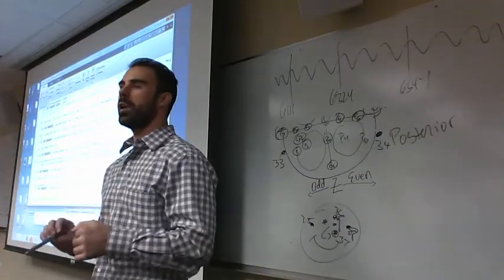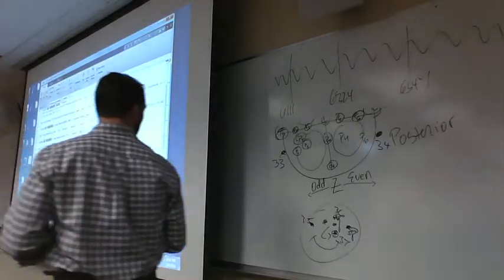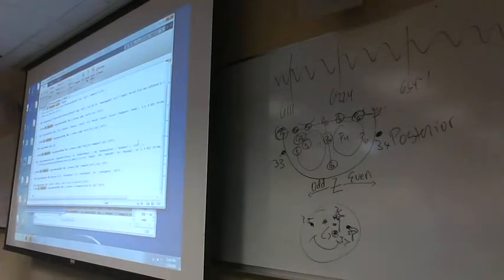at each step. I would remind you guys to be aware of the International 10-20 system. Know some of these aspects of how we built the events list, how all this stuff works in that capacity.